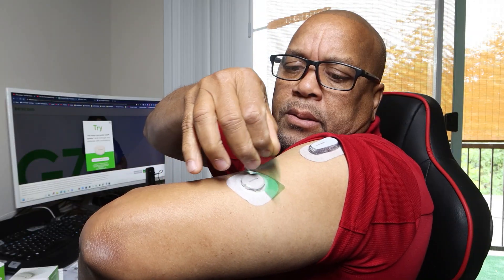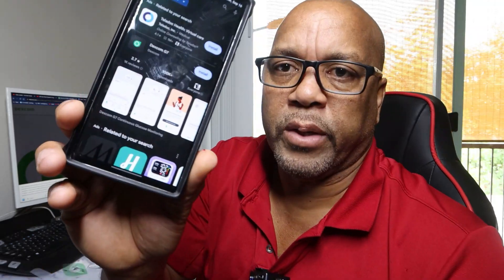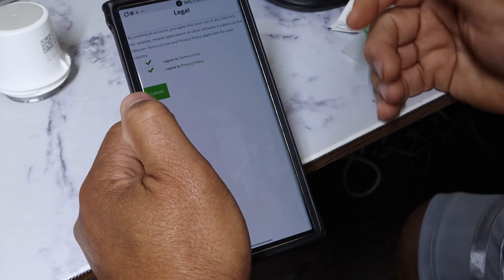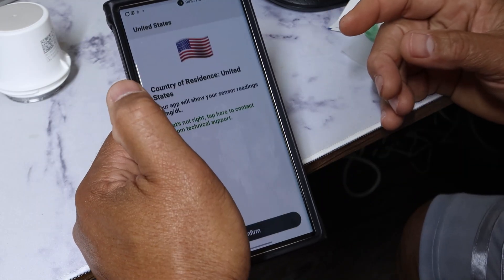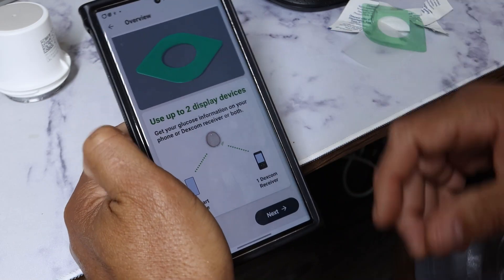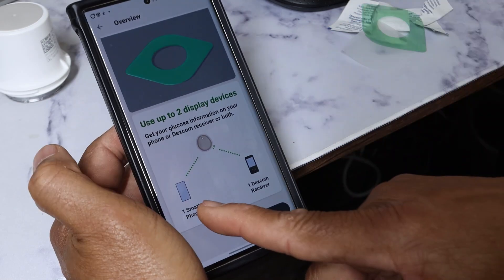We can just seal this up, go to our phone, and download the app. Here we go — the G7 app, we're going to install it. We'll get our login information, put that in, and go from there. We just logged in with our account — I'm using the same account that I use for my G6.